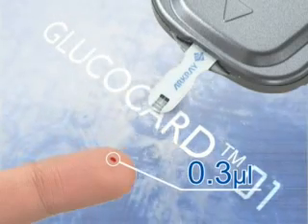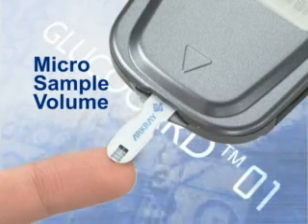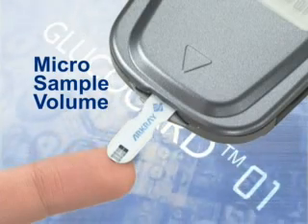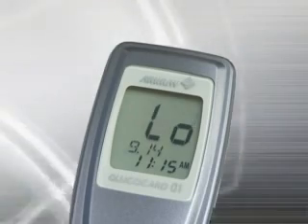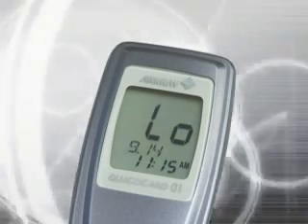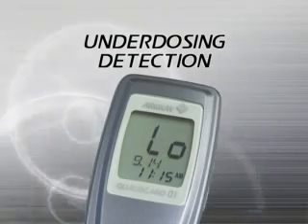All that's needed is a 0.3 microliter blood sample. A micro sample is enough for accurate measurement. And there's no need to worry about too small a sample size — underdosing detection prevents measurement errors, swiftly showing an error message on the display.